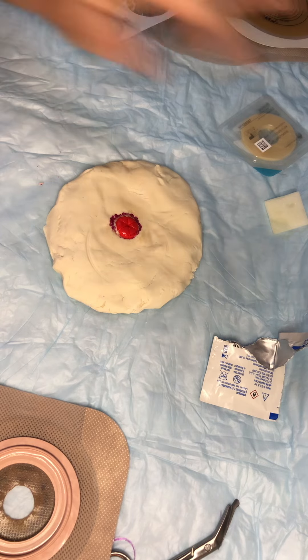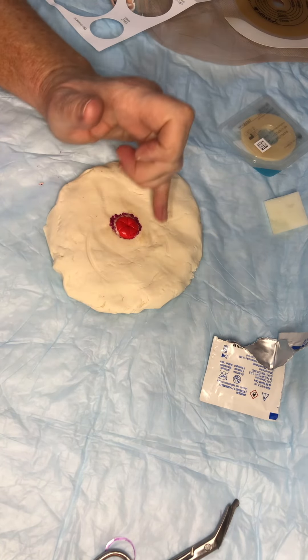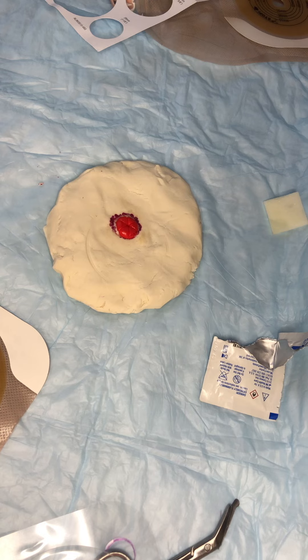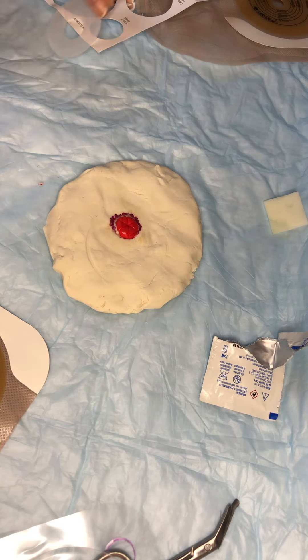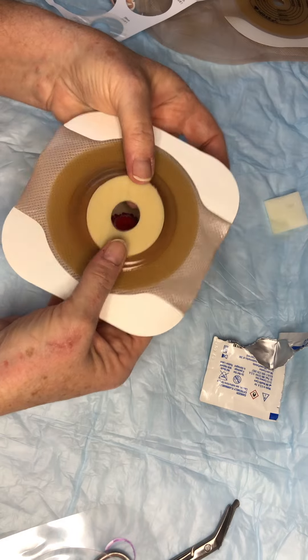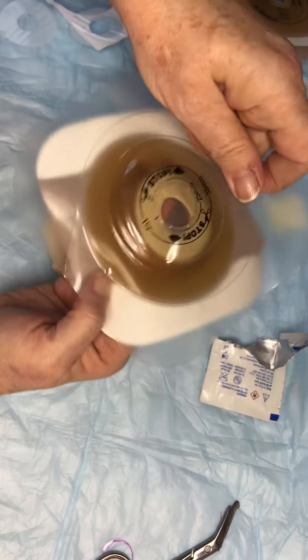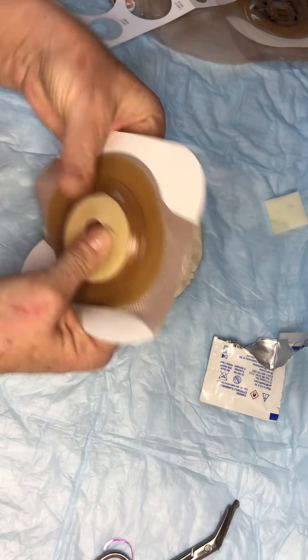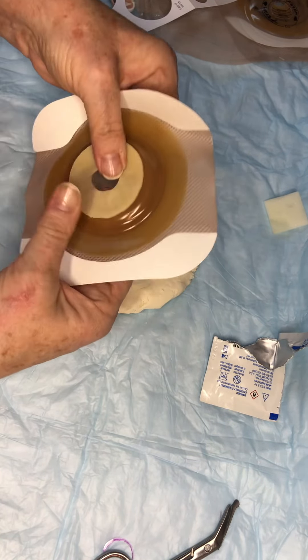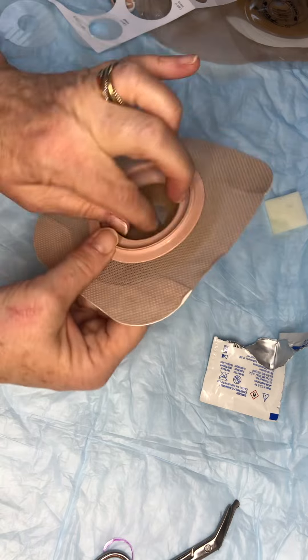Normally with a skin-level or recessed stoma I would say do not put a barrier on the back, just put this on and get a really good seal. But when you have really irritated, dry, wet and weepy skin, one thing you can do is use a really highly absorptive barrier ring made by Safe and Simple. Take that, place it right on the back here after you've taken the backing off, and squeeze it really close to those edges so it's just barely raising the barrier off your skin.